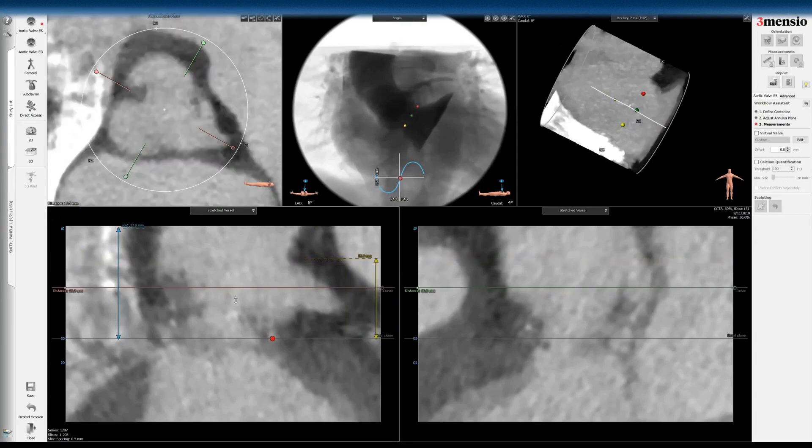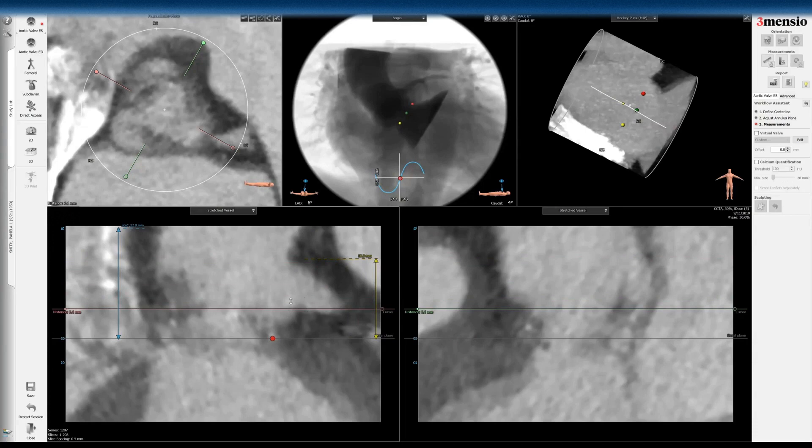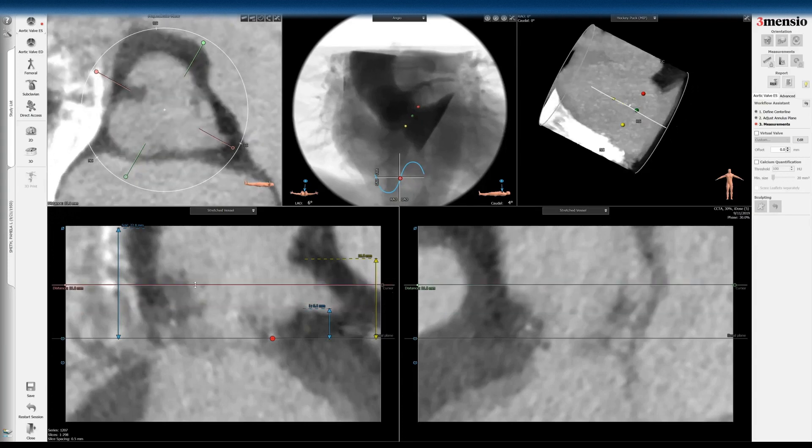This has become very much a second-nature measurement once you get comfortable with it. This is the left main height. You can see it's a low left main because these are superannular valves that implant above the annulus. You can also see what I did here is measure the left sinus height. Now I'm going to measure the sinus-of-Valsalva dimensions here — it's a little bit challenging to see.